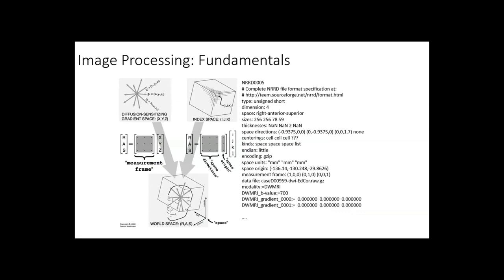If you are using 16-bit, then you get a much wider range, so you can get much better contrast for this image.